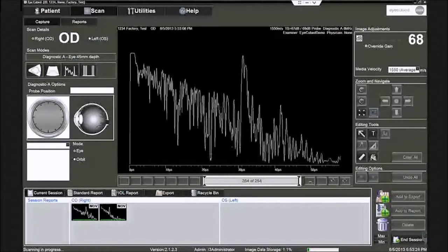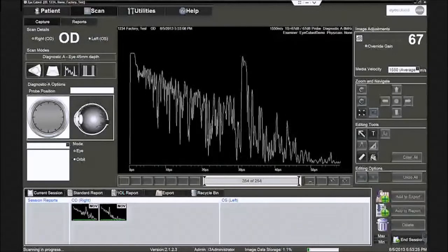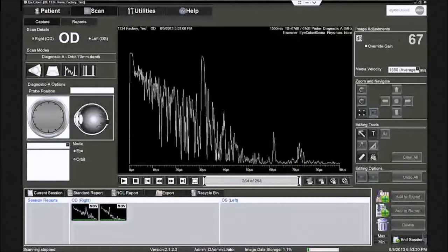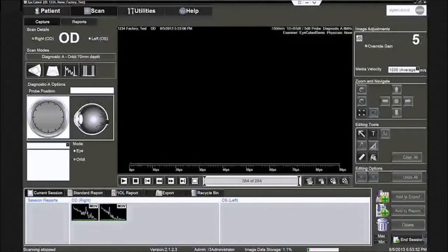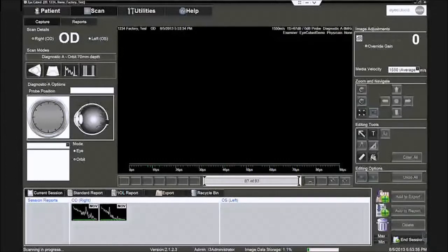The tissue sensitivity is determined in the factory using a special tissue model and stored under Patient ID 1234. The solid state electronics of the eye cubed ensure that this setting does not vary.